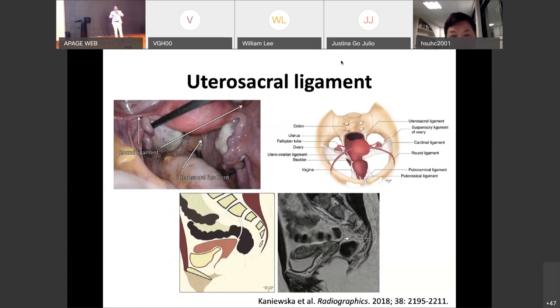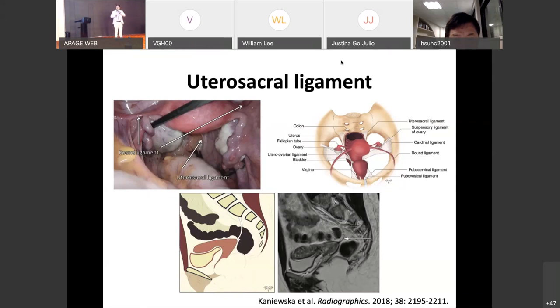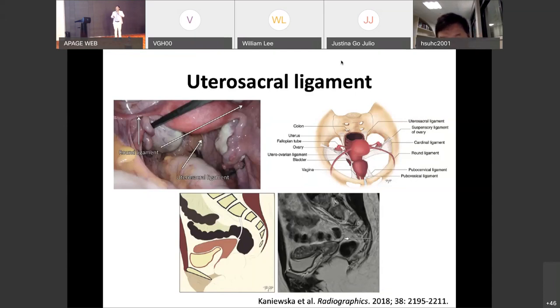I would like to use this chance to review the video we saw this morning and to identify important structures. As Professor mentioned, standardized laparoscopic surgery is very important and we radiologists are trying to catch up with you surgeons. The first structure is the uterosacral ligament — it runs from the sacral bone to the uterus. The best imaging to identify it is the sagittal T2-weighted image, where you can see a linear structure connecting from the sacral bone to the posterior surface of the uterus.